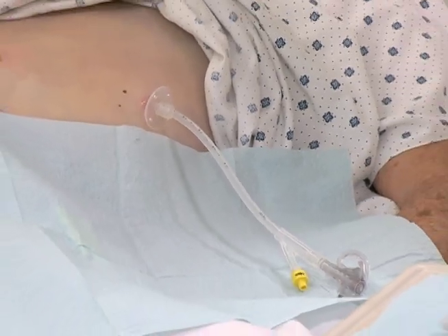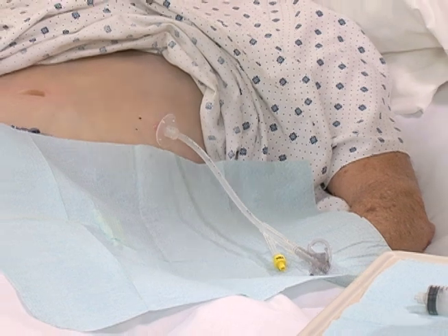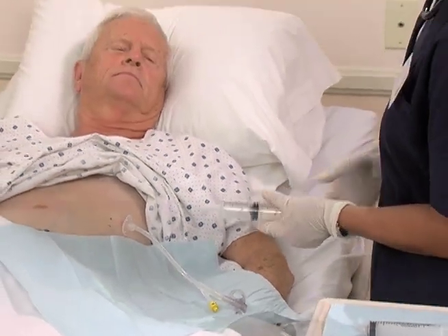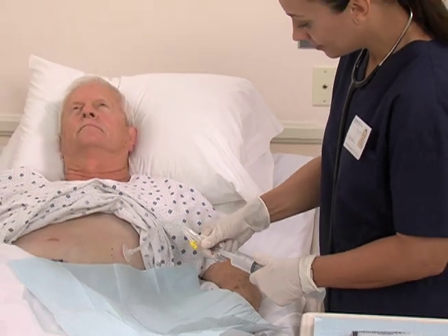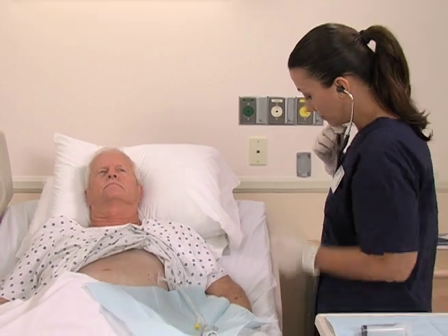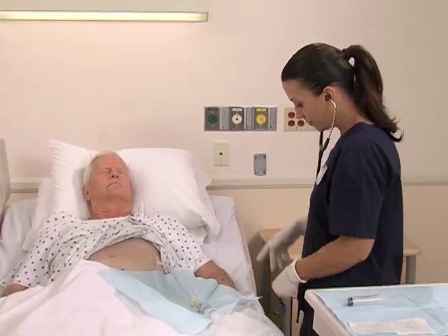The increased use of gastrostomy tubes for long-term feeding and other treatments has made the replacement of balloon gastrostomy tubes an increasingly common nursing procedure. This program demonstrates the basic techniques for the care and replacement of a balloon gastrostomy tube.